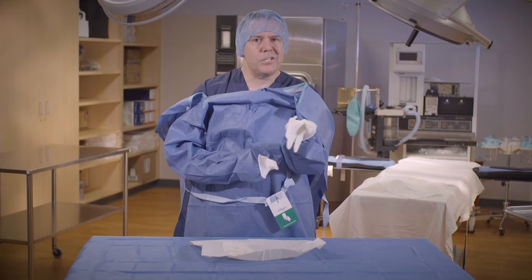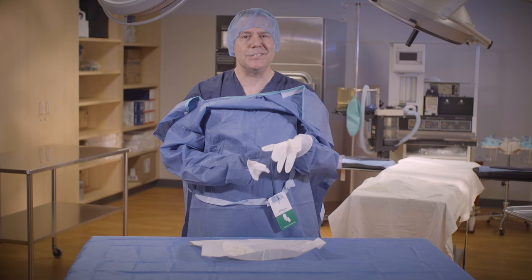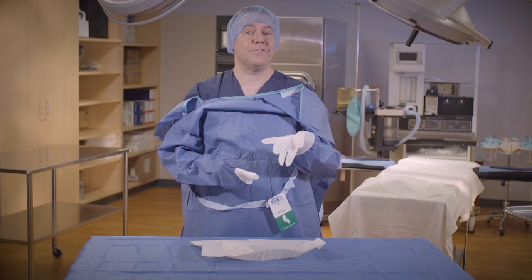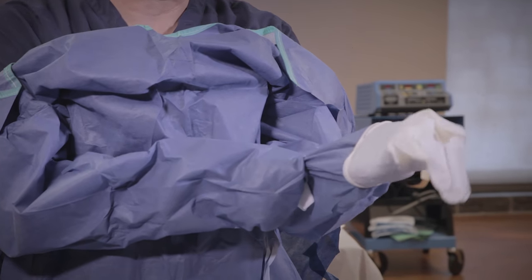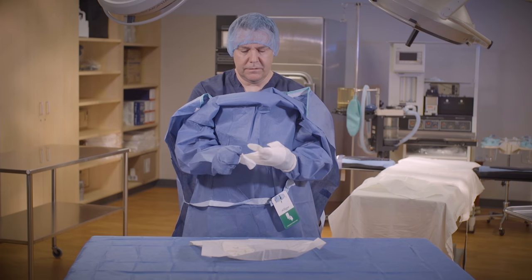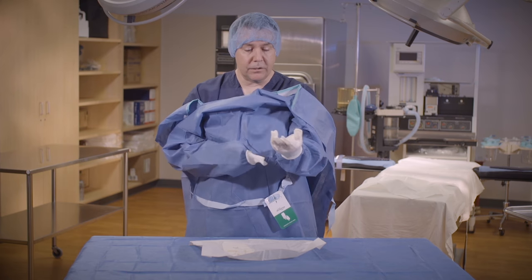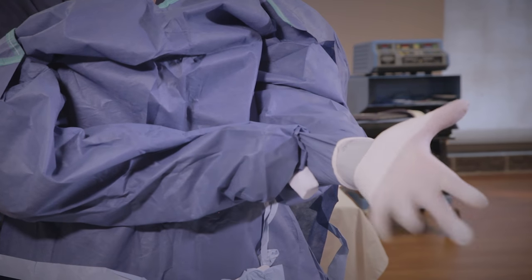Now don't be gentle with this. This glove is made of latex, not crystal. Sometimes I'll see students barely stretching that glove over, which makes it very, very difficult to glove. And then I like to pull the gown — not the gloves — extending my fingers into the glove. Because this is still sterile, I can touch my fingers on my gloves. And then again, pulling on the gown. And there we have a good left hand.